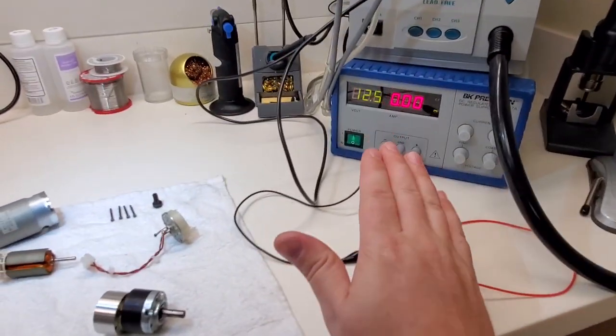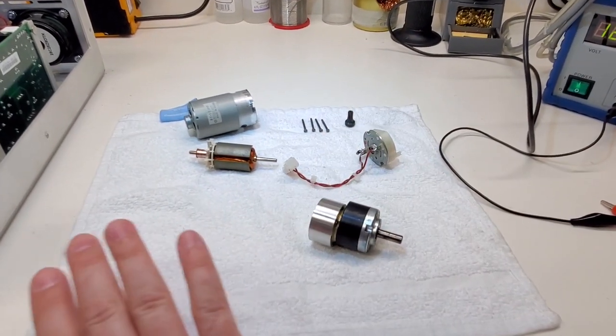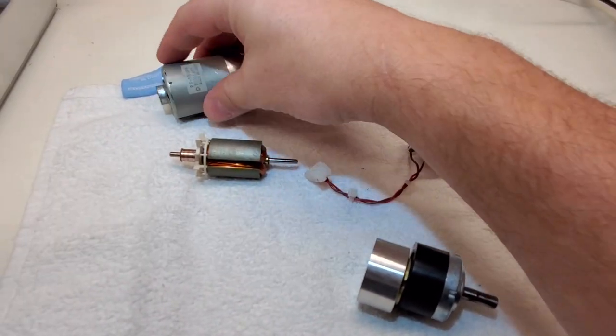And we tested it with the regulated DC power supply and your data sheets. Use your data sheets. So let's take a look at your brushed DC motor. Let's take a look and see what we got.